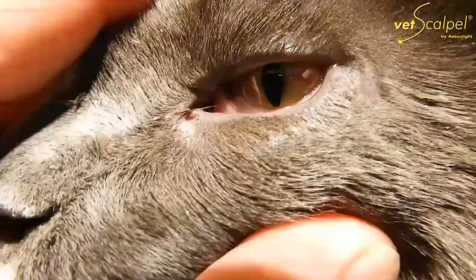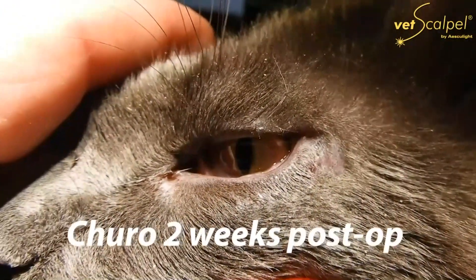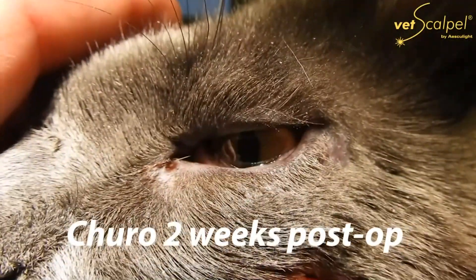Chiro did very well. He was on eye drops post-op, and two weeks post-op he came in for suture removal. He did not need sedation for removal and he healed perfectly.